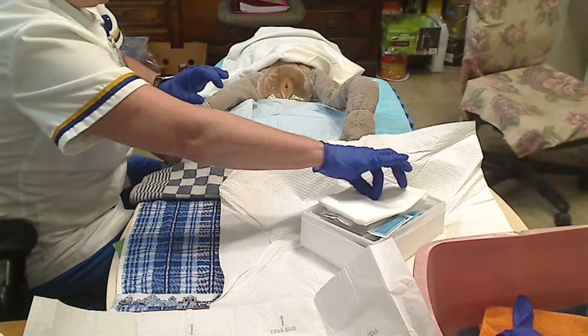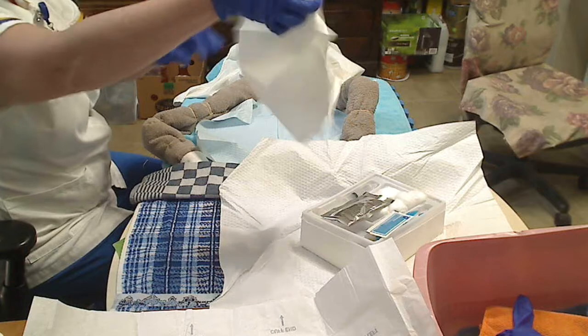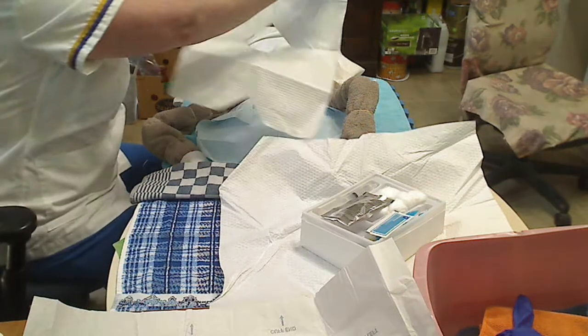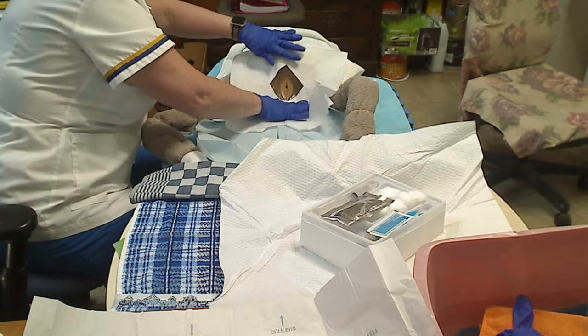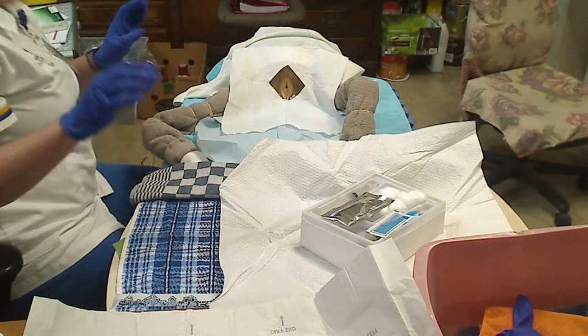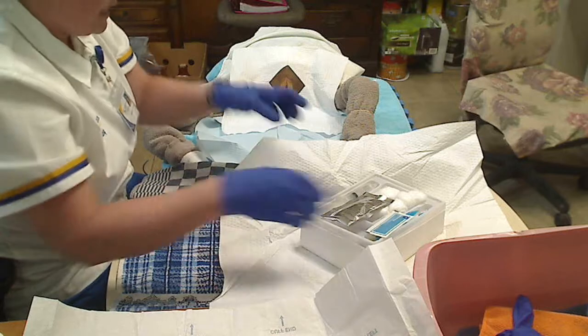I'm going to open up my next drape, which is going to only expose just the specific area that I need. Anna, are you doing okay so far? Yes. Okay. It's going to take me a second. I need to organize my kit. So one more moment, okay?